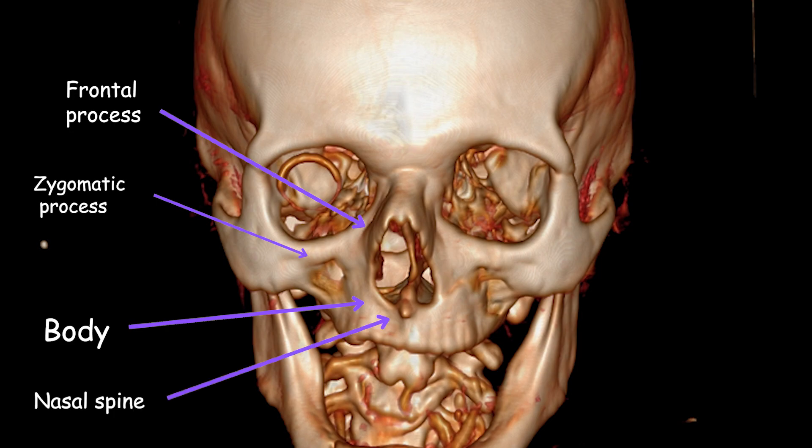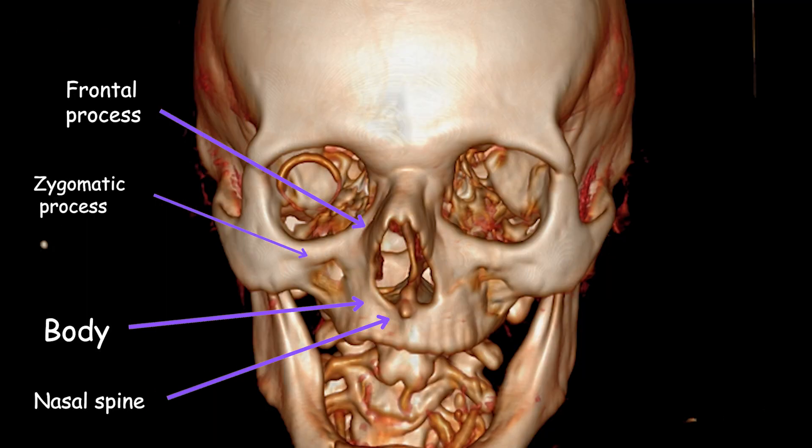The nasal spine is a bony projection located at the midline of the maxilla. It provides structural support and stability to the nasal region, helping to anchor the nasal bones and maintain the shape and alignment of the nasal pyramid. The infraorbital foramen is a small opening or hole in the maxilla, typically oval-shaped, situated on a slightly raised area known as the infraorbital crest or ridge. It plays a vital role in providing innervation and blood supply to the lower eyelid, cheek, upper lip, and surrounding facial structures.